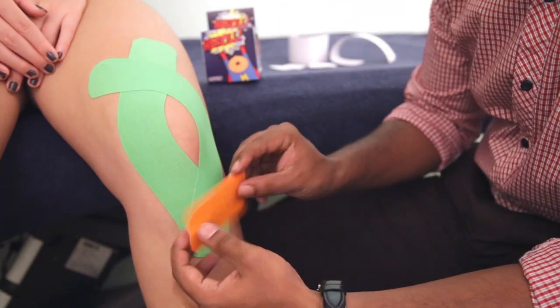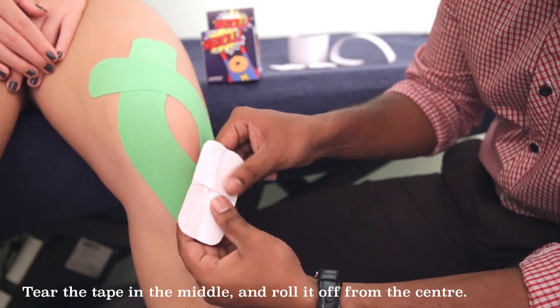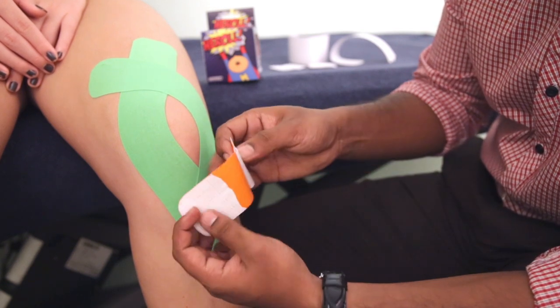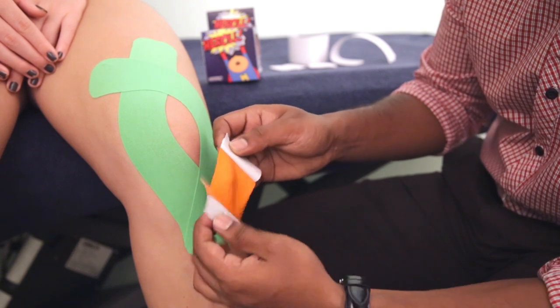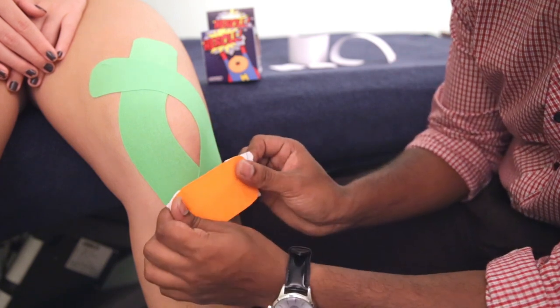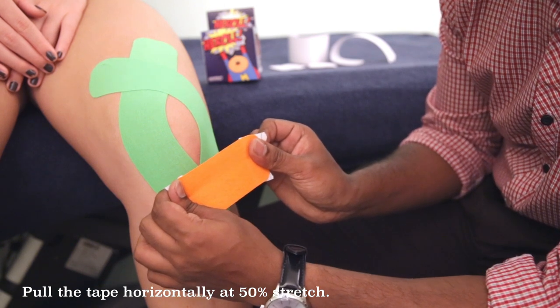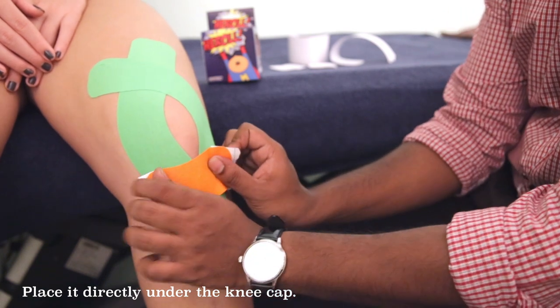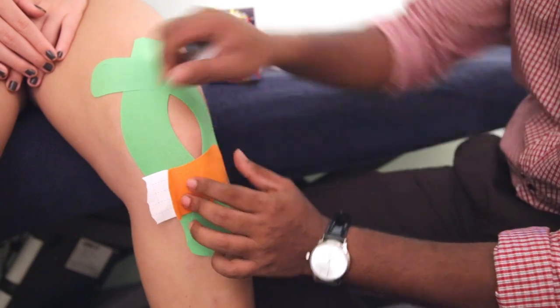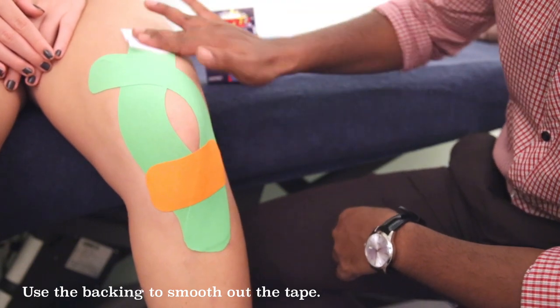Lastly, we will be using the 10cm strip. We will be tearing it right in the middle and rolling it on either side, so that we are left with about 2.5 boxes on either side. Flip it around. We are going to be pulling horizontally on either side to 100%, come back to about 50%, and we are going to paste it directly under the kneecap. Once it is well pasted on, relax on the anchor on either side with no tension. Then use the backing to rub everything down again. And we are done.